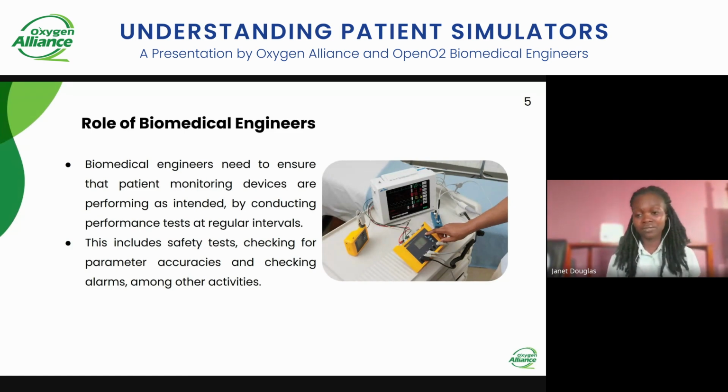You can do safety tests. When it comes to safety tests, mostly we look at the performance of these devices, because if you don't test their performance, you put at risk the life of the patient and even the safety of the user. We also have to try as much as we can to check the parameter accuracies and the alarms, whether they are able to beep when there's a need for them to do so, among other activities that you can do.